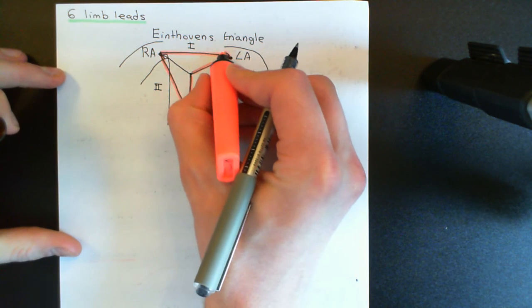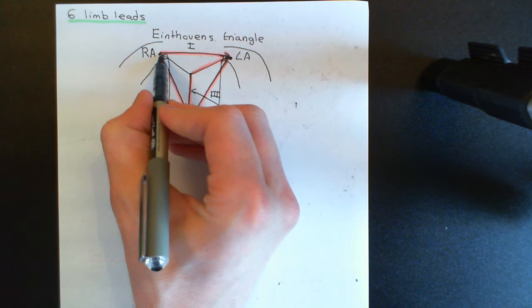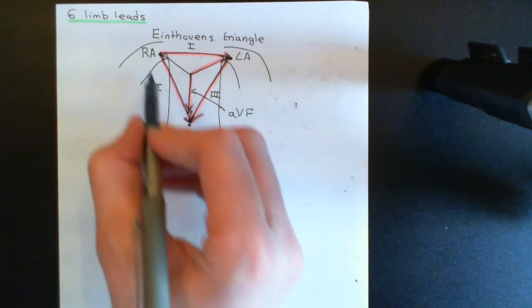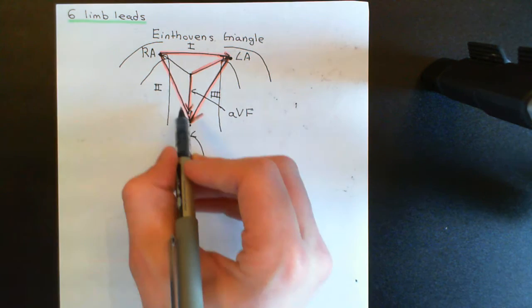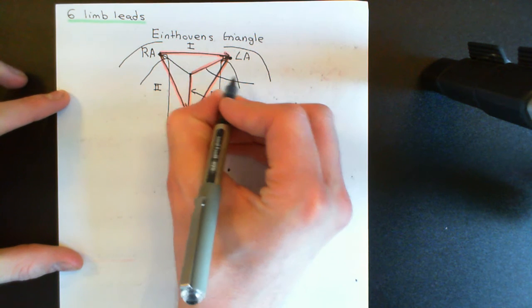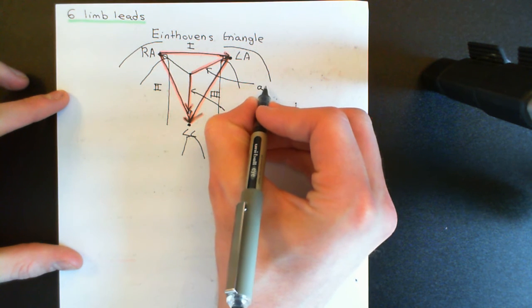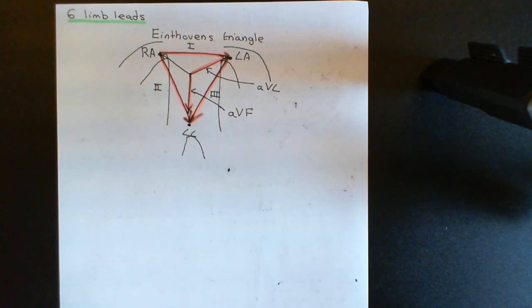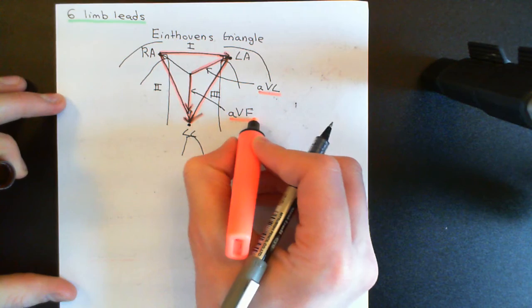So let's go to this one here now. What we can do here is average the electrical potential at the right arm and the left leg. We'll get a number, and then we're going to say what's the electrical potential difference from the average of these 2 to the left arm up here. And if we follow that electrical potential difference over time, the ECG that we get is known as the AVL ECG, the AVL lead. Okay, AVL clearly for left arm up here.